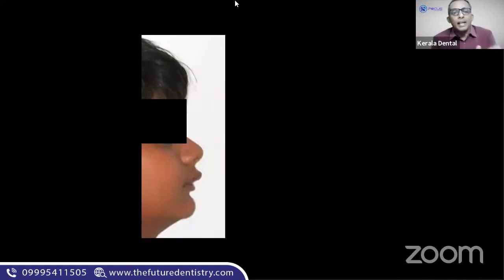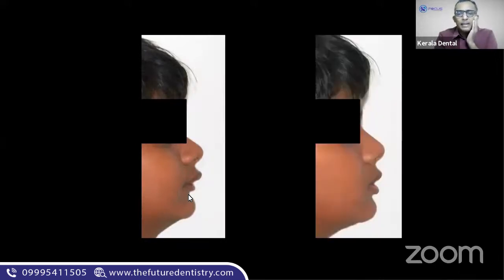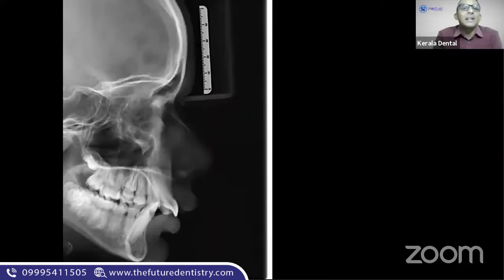And look at this guy. Look at that mentolabial sulcus here. Look at that profile difference here just by bringing the mandible forward. But how did you diagnose? That is the importance of cephalometrics. So why do you need cephalometrics? Cephalometrics confirms your diagnosis between dental and skeletal. We cleared that there's no dental problem. We cleared that there's a skeletal problem.